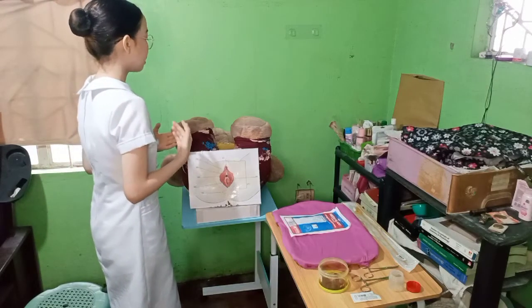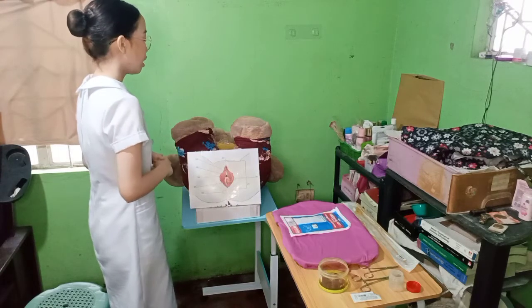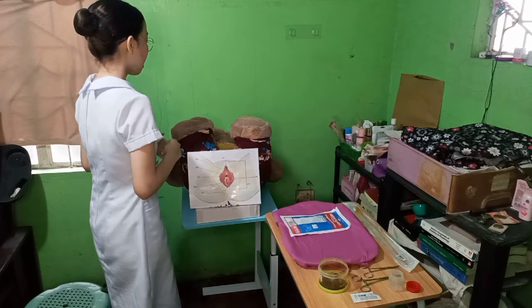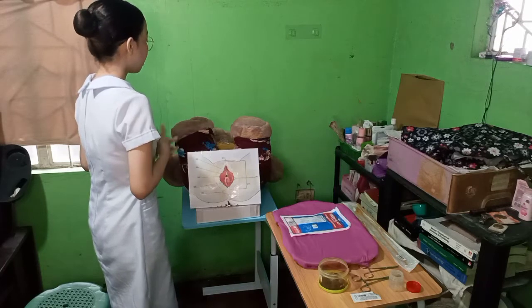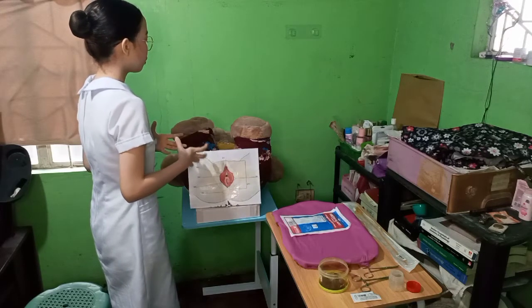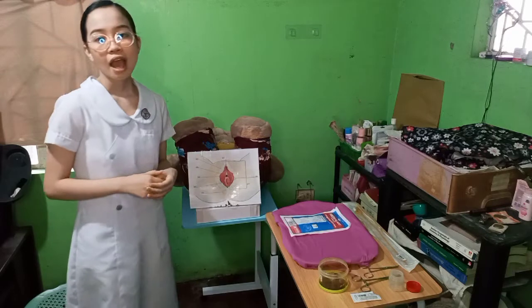Today, ma'am, I'll perform perineal care to maintain the cleanliness and prevent infection in your perineal area, and this would also provide you a sense of comfort. And also, I'll be performing straight catheterization. This is the method that we use to empty your bladder, and it facilitates the presenting part of your fetus to descend in your pelvis, and will prepare you for the delivery of your newborn. Will that be alright? Explain the procedure to your client, why is it necessary, and how she can cooperate.